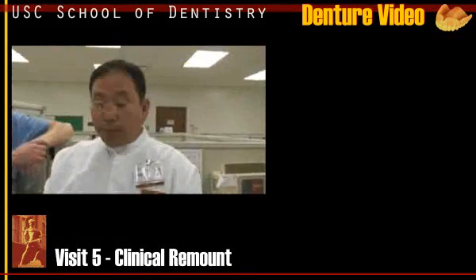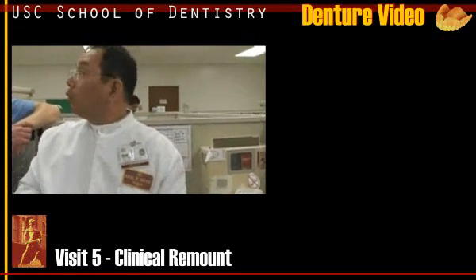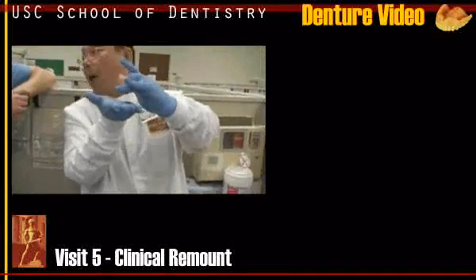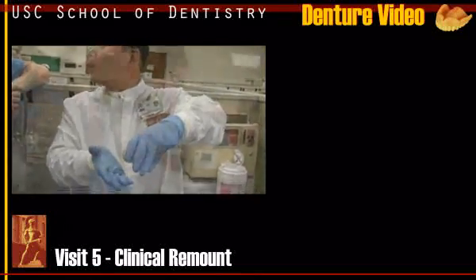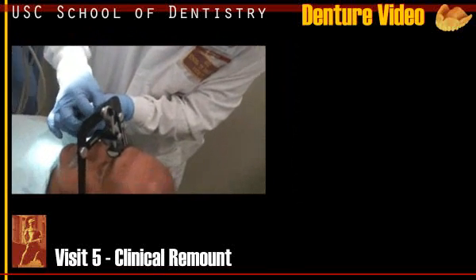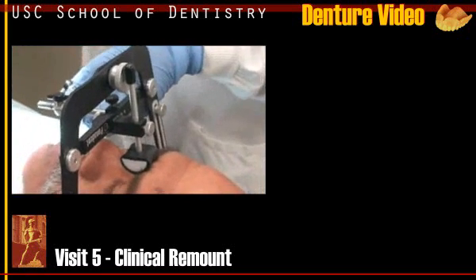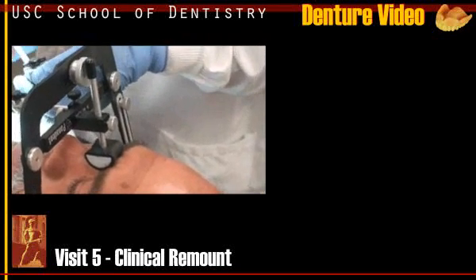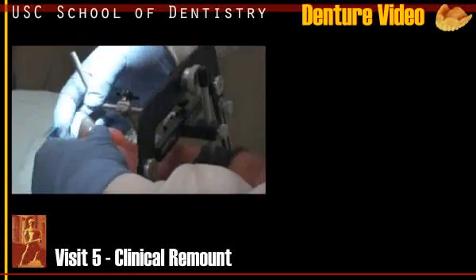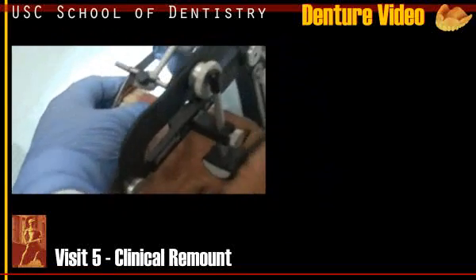So don't worry. And then if you're really lazy, usually what we recommend is mix the white plaster, make about half an inch, and then you make an indentation. So A goes to A, right? Open back. Try to make it more accurate.